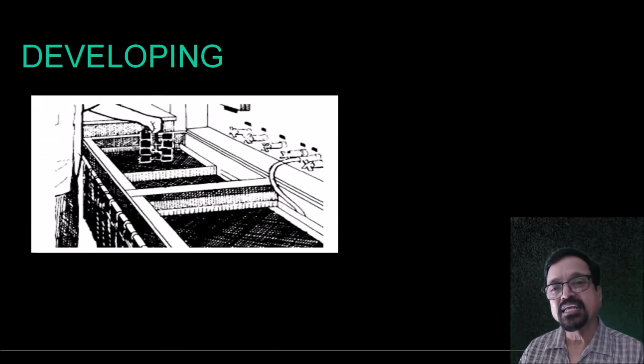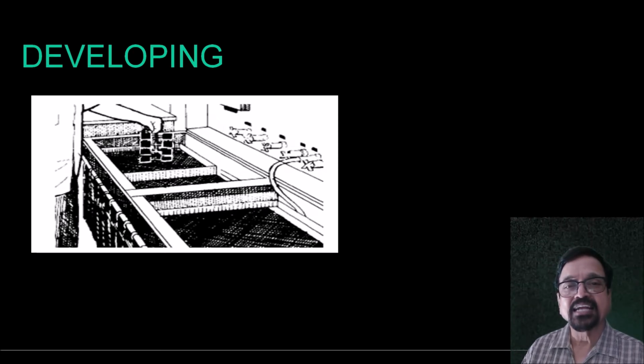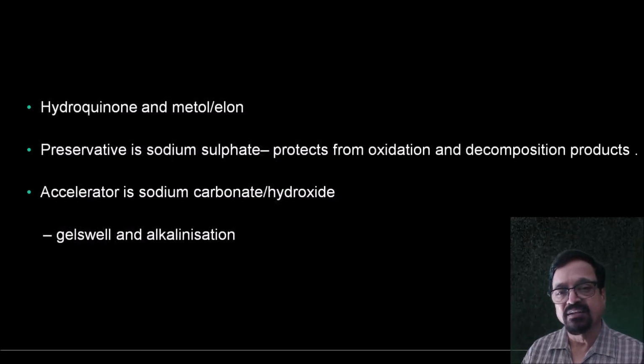Now these are the developer and fixer, how they are shown in their tanks, how they are filled, how they are drained, and here there is importance of drainage as well as electrification.